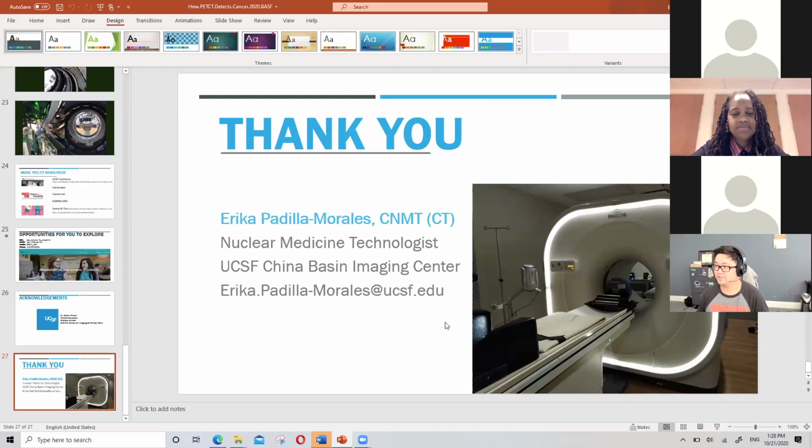So Erika, in the Q&A tab, there are a few questions. Some are very specific, and then others. So one question was, can you explain how PET-CT helps to monitor a possible recurrence of cancer? Yes. So a lot of our patients come back twice a year, 4 times a year, 6 times a year. If they're part of clinical trials, they might even come more frequently than that.